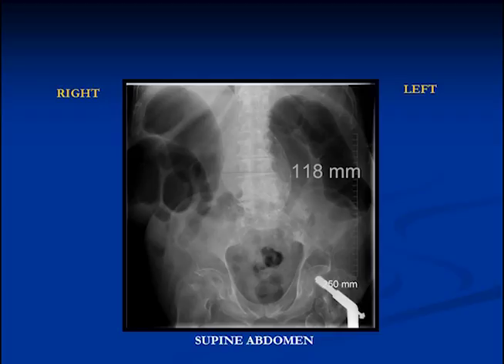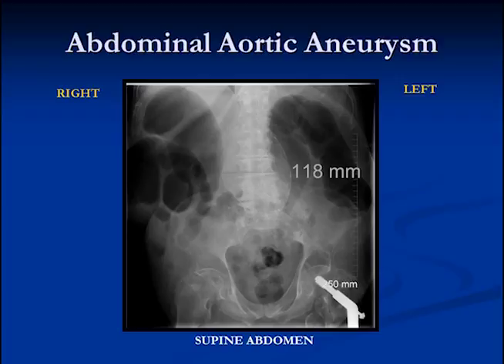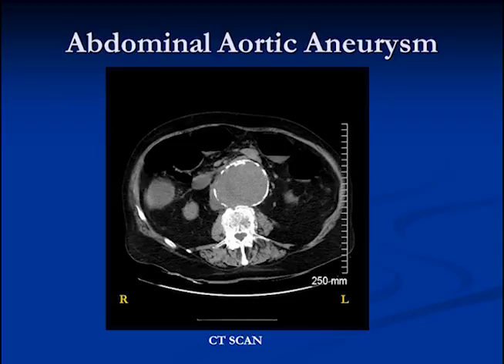There's some calcium in this view. This patient has an abdominal aortic aneurysm — there's a great bulge in the aorta, which is densely calcified and can be seen on a plain film quite commonly. On CT the aorta, which is usually about two to three centimeters in diameter, is here about five centimeters in diameter — this is an abdominal aortic aneurysm.